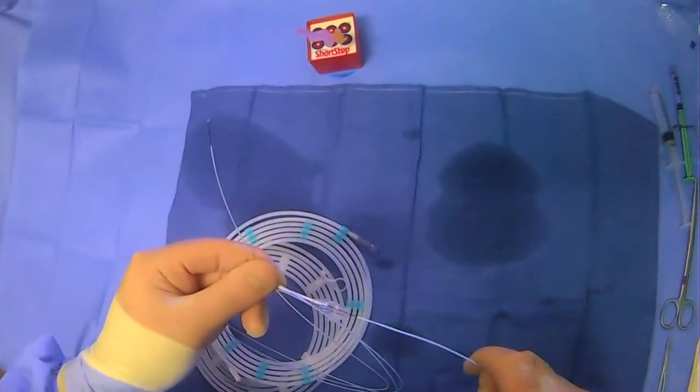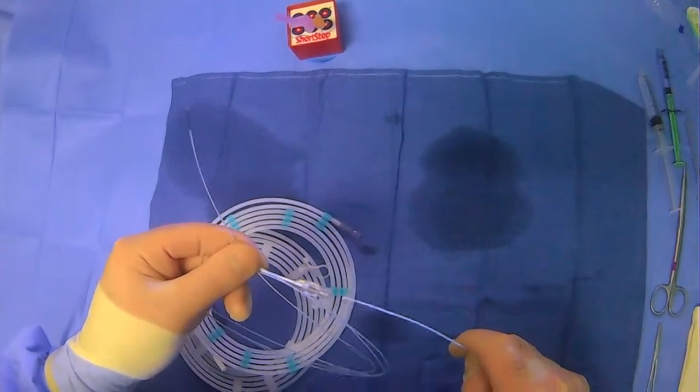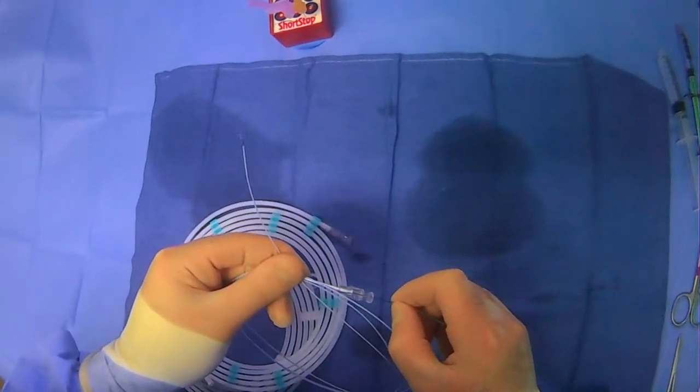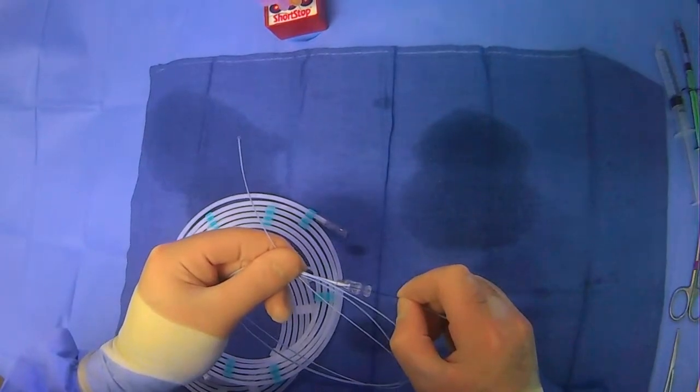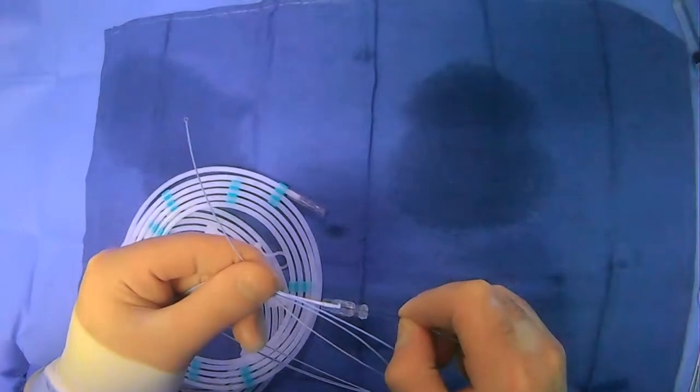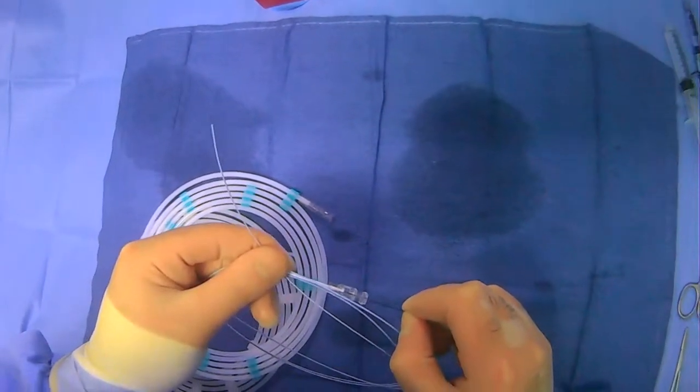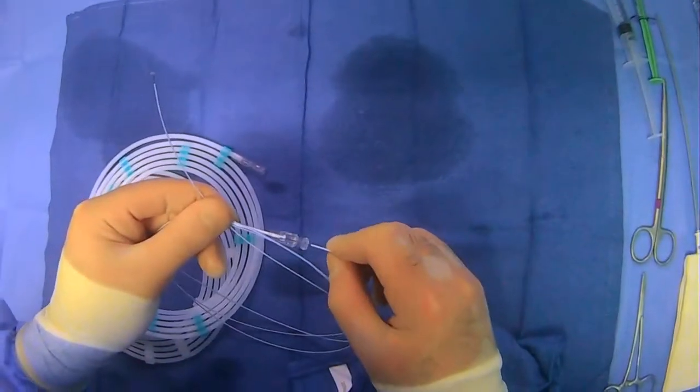So it gets a little tough with the microcatheter, but you basically are just pulling and pushing to bring the snare in and out of the microcatheter here and to actually snare something. And that's the basics of how this works.